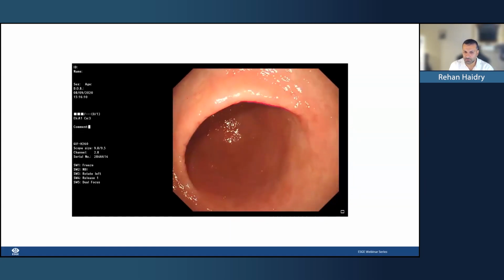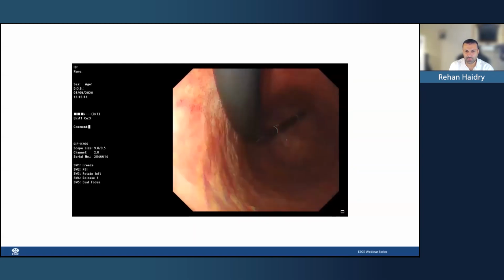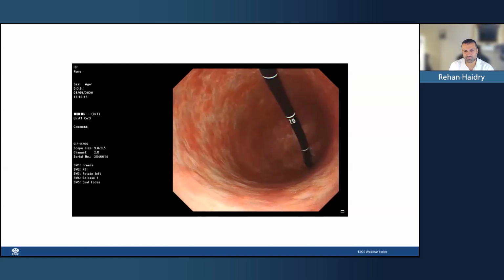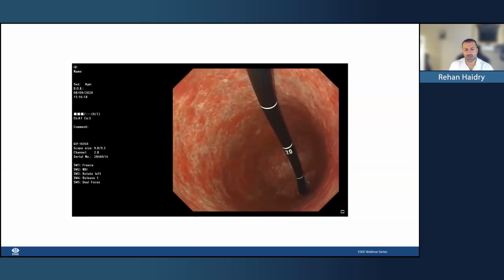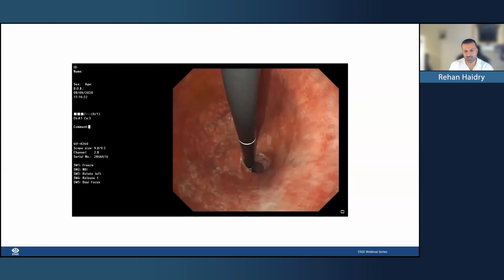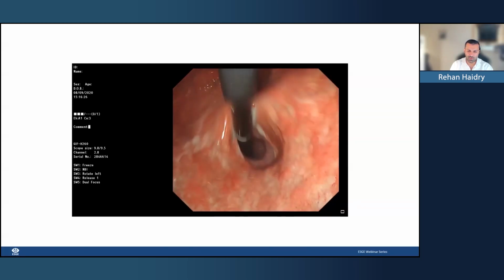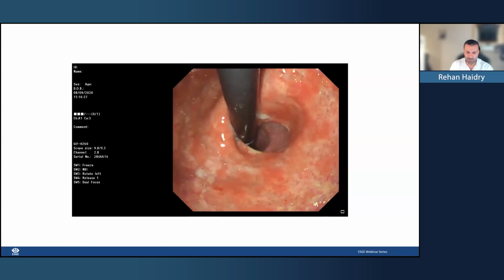And then as soon as we now begin to go into the antrum and the posterior antrum in the retroflex view, you can see there are no gastric folds here. So this is panatrophic gastritis. You can see there's a flat stomach. There's lots of areas of paleness, and then you can see these abnormal collecting venules.